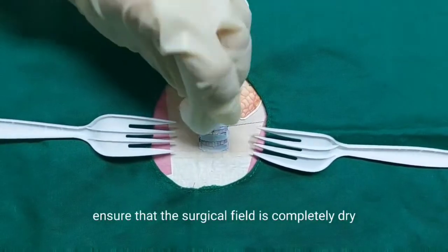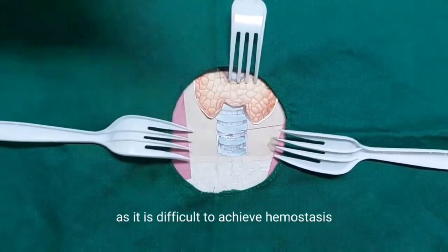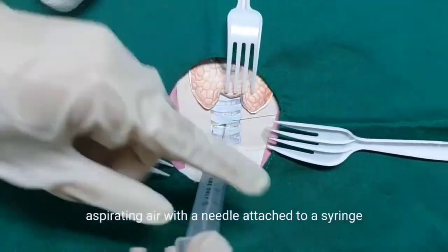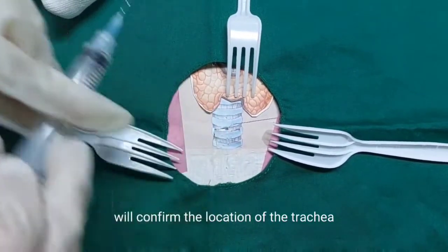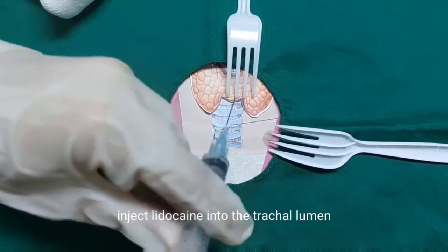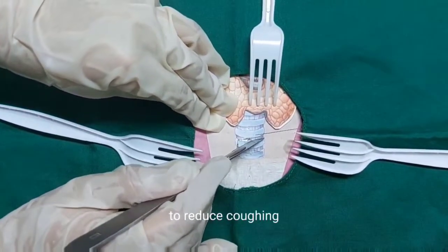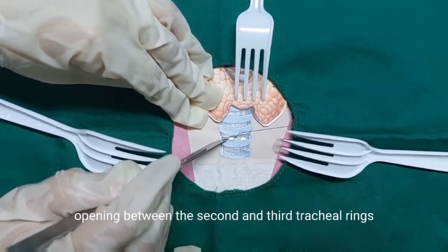Ensure that the surgical field is completely dry before proceeding, as it is difficult to achieve hemostasis once tracheostomy tube has been inserted. Aspirating air with a needle attached to a syringe will confirm the location of the trachea. In the awake patient, inject lidocaine into the tracheal lumen prior to incising the trachea and inserting the tube to reduce coughing. Create the tracheostomy opening between the second and third tracheal rings.